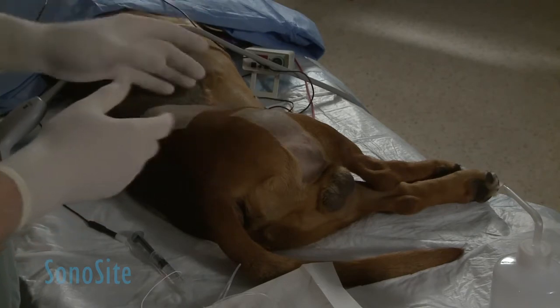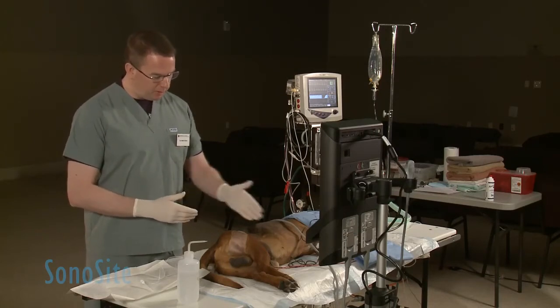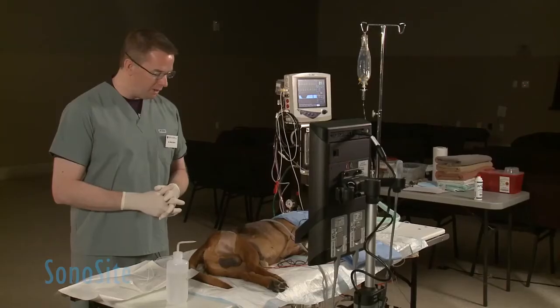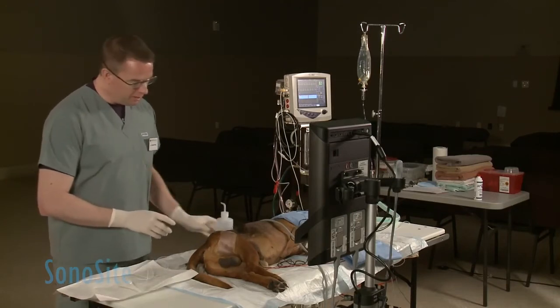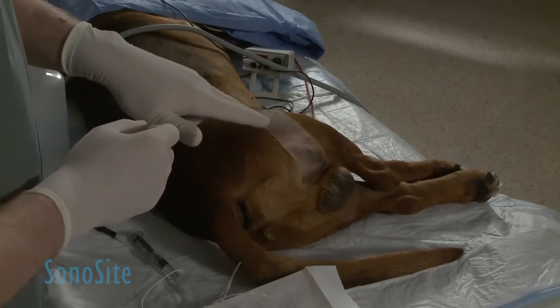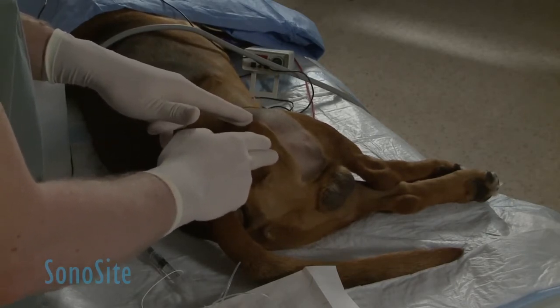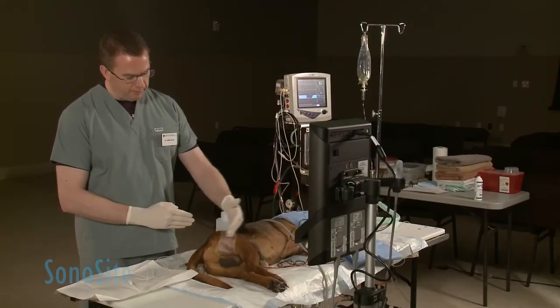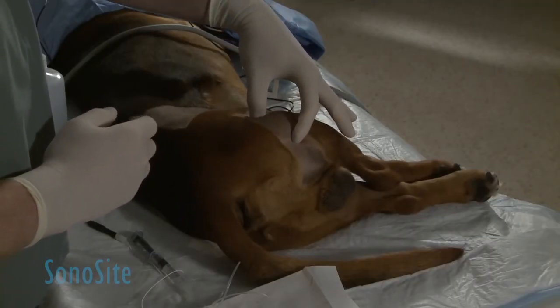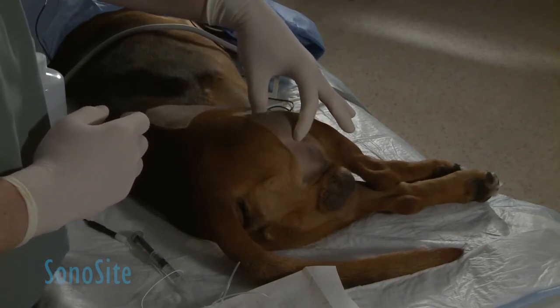The anatomy that we're looking at today — we've already pre-clipped this animal for the sake of showing you the anatomy. Typically, the animal would be clipped for its surgery relevant to the procedure being performed. We've pre-clipped an area distal to two bony landmarks: we palpate the greater trochanter of the femur and the ischiatic tuberosity on the pelvis. We also find the biceps femoris muscle on the lateral side of the thigh, which is the main landmark we're going to palpate as we place the ultrasound transducer.